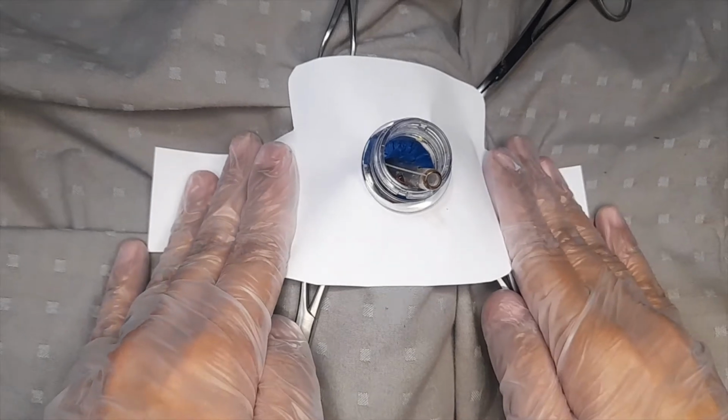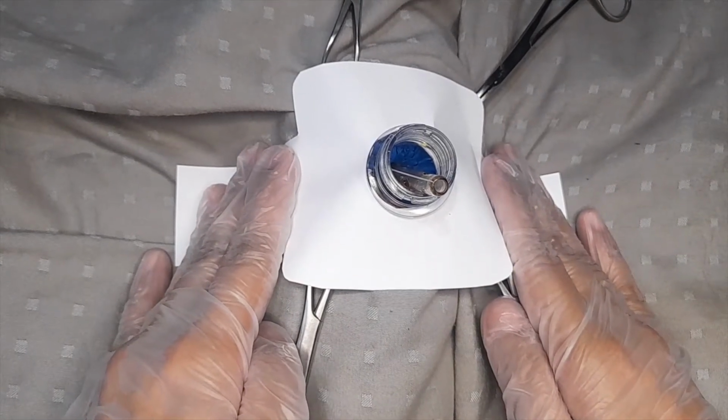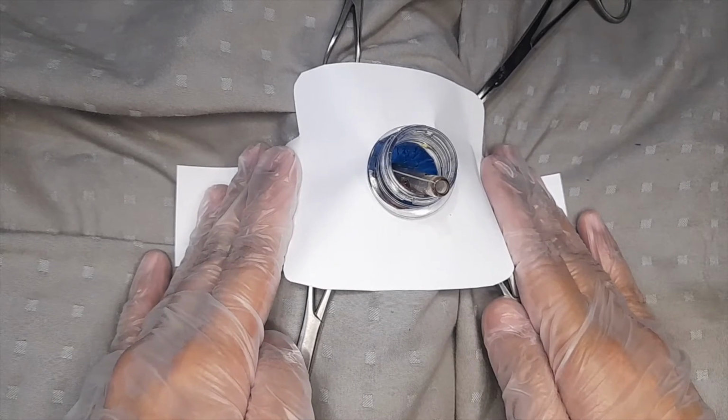Secure the flanges of the tracheostomy tube and pass them around the neck. Tie them with the neck flexed.